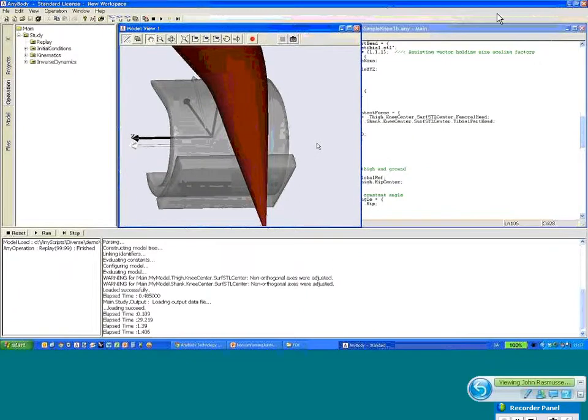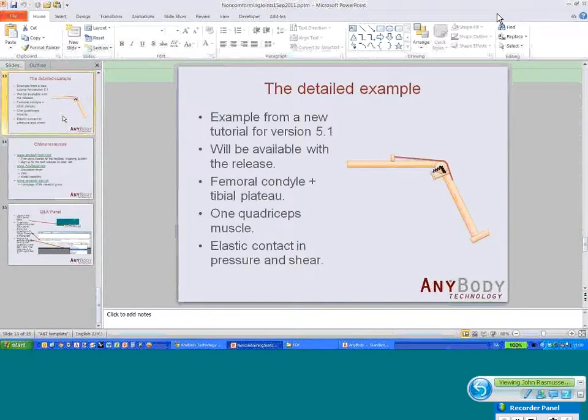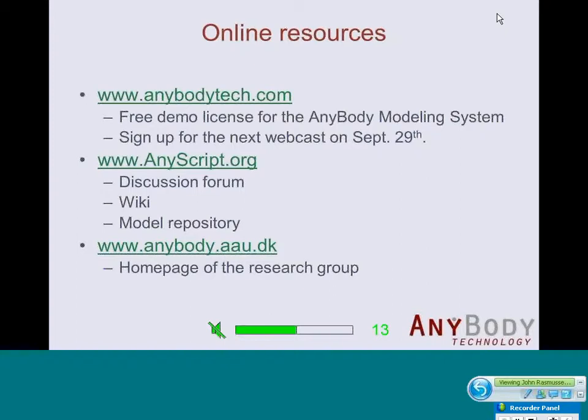In reality, it takes more time to do this than what you've seen here. This is just a replay of data that I did earlier. And of course, again, it takes some time to do the analysis, but it is definitely not an unfeasible amount of time. It is still something that you can do within a reasonable amount of time on a normal desktop computer. So with that, I would like to go back to the presentation and just kind of round things off.